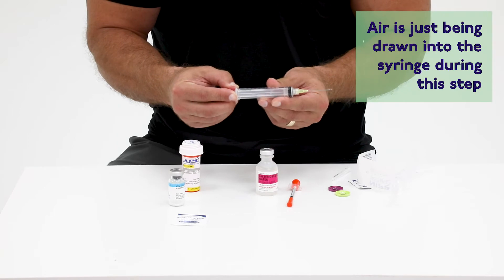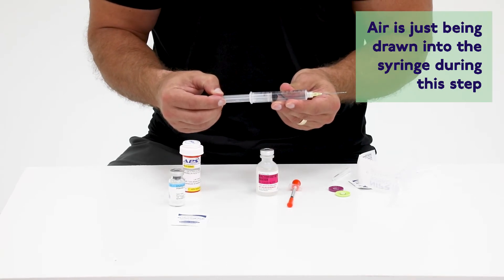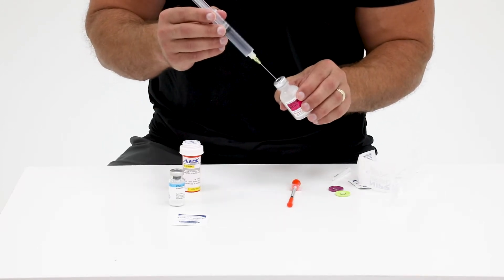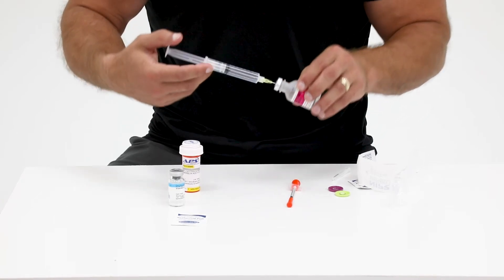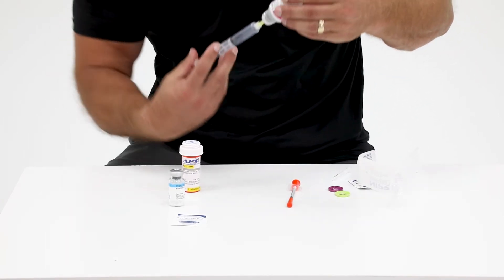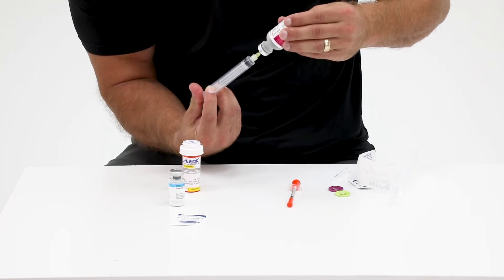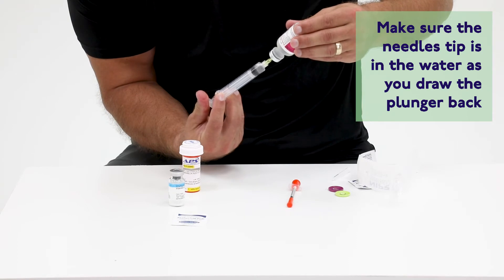Pull back the plunger to the black line that your health care provider has prescribed. Hold the barrel of the syringe as you insert the needle through the rubber stopper of the water vial. Once the needle is inside, flip the vial upside down and push the plunger all the way to transfer the air from the syringe into the vial of bacteriostatic water.